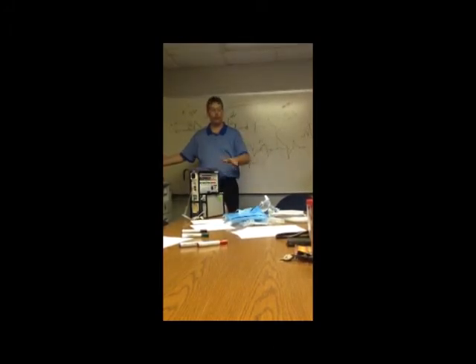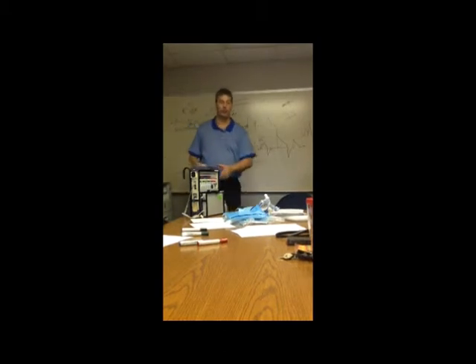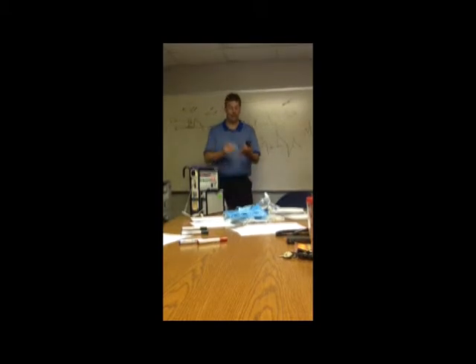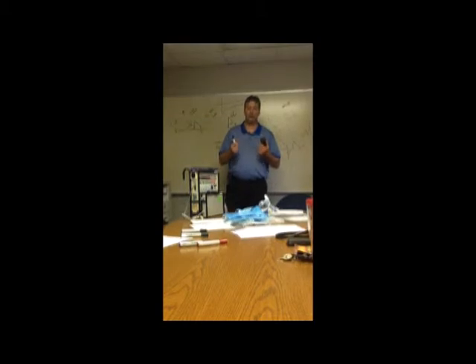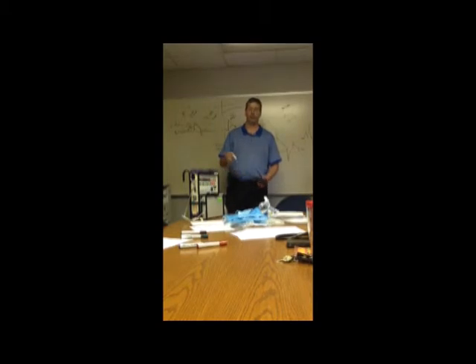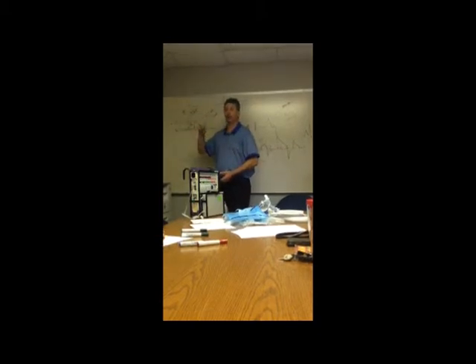Now, do you adjust the PEEP at all? I would not adjust it. We'll go ahead and talk about BiPAP. We'll get this over with. We don't adjust PEEP on BiPAP for any kind of work of breathing problems. The only thing you adjust for tachypnic, I'm working too hard, I'm even retracting, which is pretty bad in an adult, or they're sweaty and can't hold still, and you know it's because they're uncomfortable with the respiratory rate, IPAP is what fixes that.